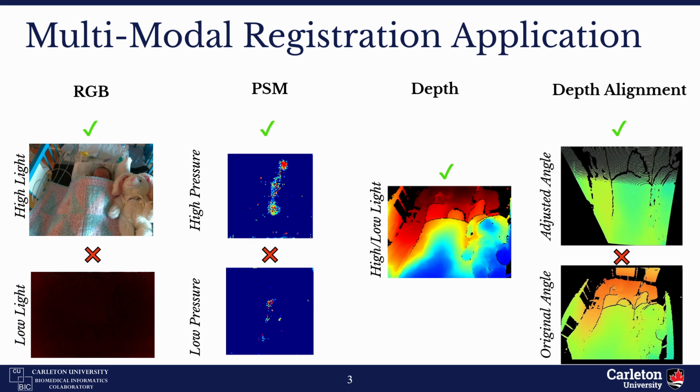For example, if the patient's weight is too low to capture enough pressure data, or if the patient's limbs are moving freely and not creating enough pressure on the mat, the RGB and depth data can be used instead, as they would be robust to these issues. Multimodal registration aims to overcome vision-based and pressure-based challenges during neonatal patient monitoring by combining multiple modalities to compensate for one another in case one of them fails.